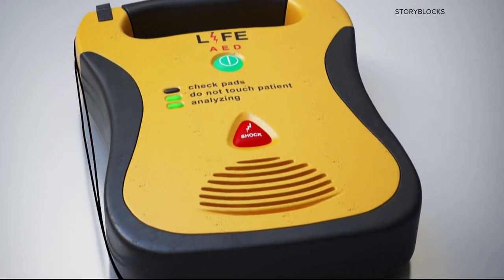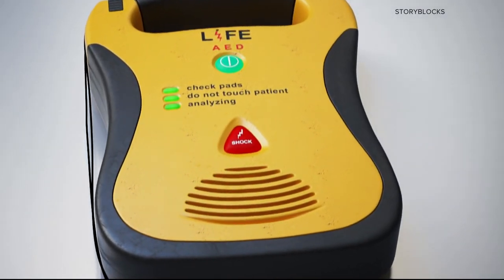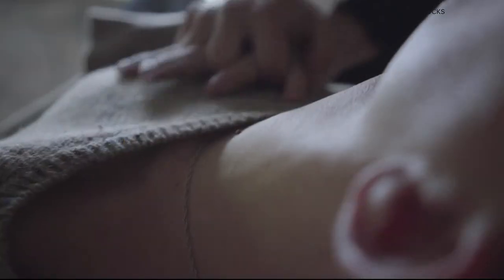Shout 'CLEAR' before pressing the shock button if the machine prompts you to do so. After that, or if no shock is advised, begin CPR compressions.